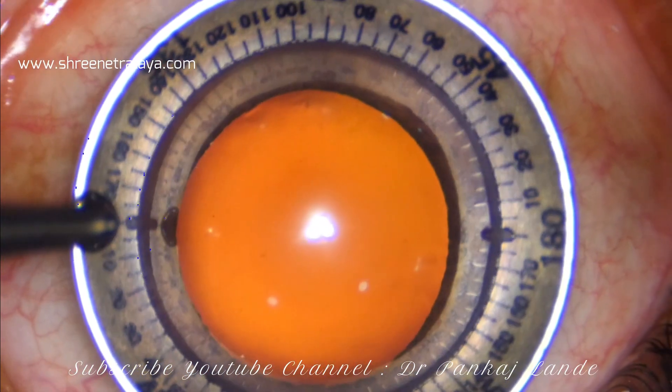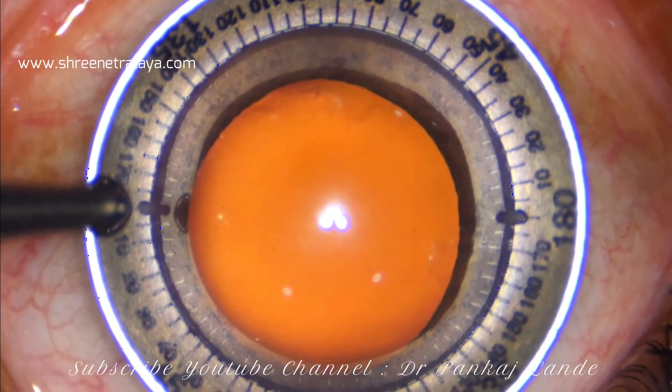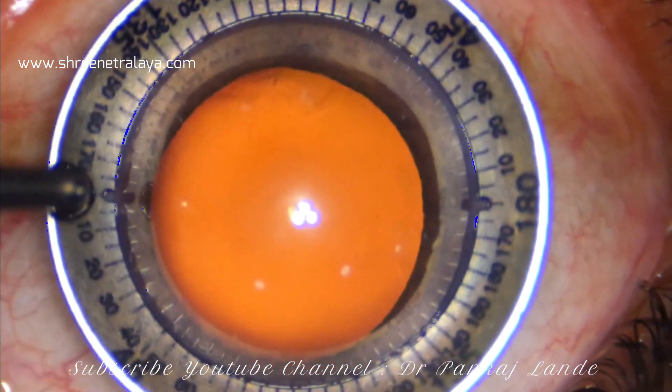This case is a soft cataract and the patient is wearing glasses of minus 9. The patient is myope with a cylindrical power of 0.75.